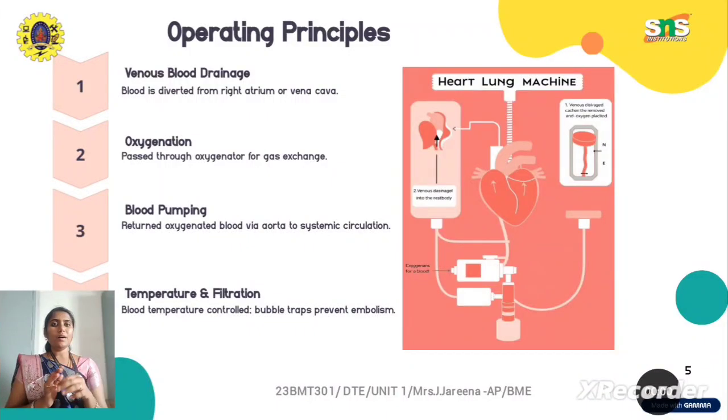Hi everyone. In this class, we are just going to have the continuation of last class. In last class, we had a basic introduction of what is a heart lung machine and what are the basic components involved in a heart lung machine, right? So, following this, today we are going to have a discussion on the operating principles of the heart lung machine.